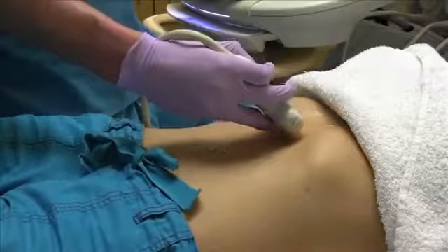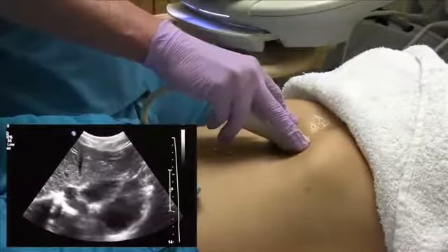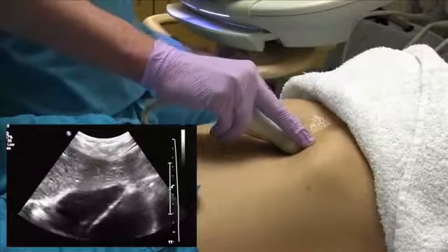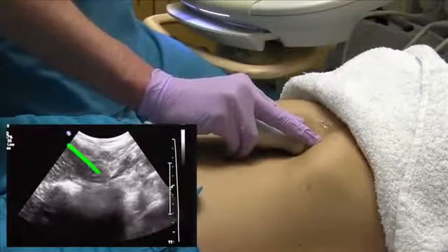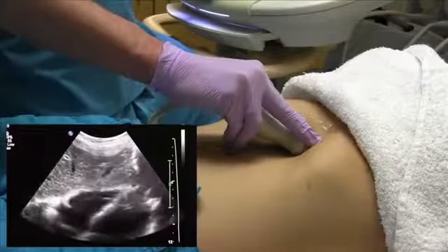Next we go transverse, and for that we're going to start again with the left lobe, subxiphoid, and you kind of grab the top of the probe here, and you want to make sure you sweep all the way up through the left lobe till you see the heart. And then as you come down, very similar protocol.